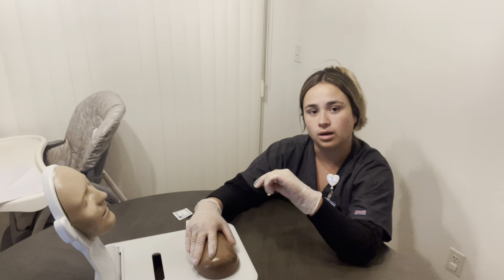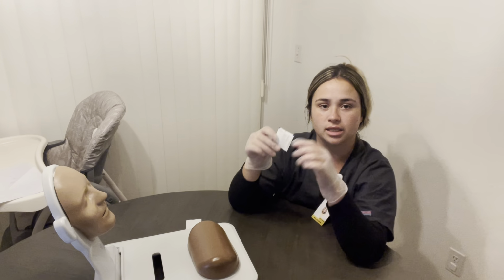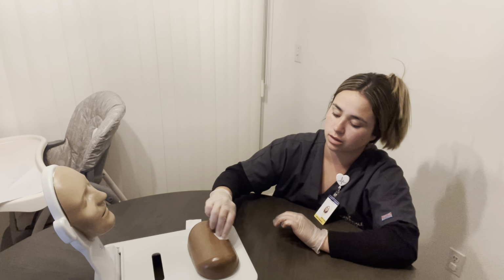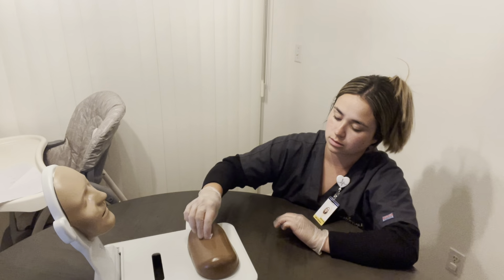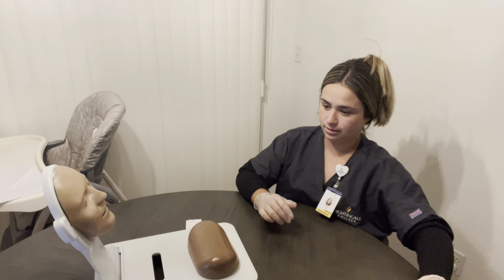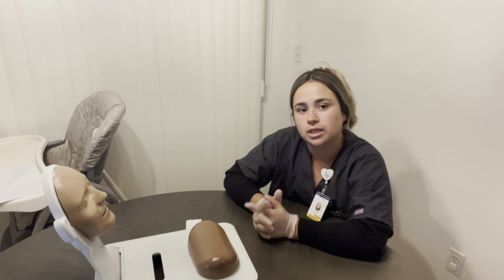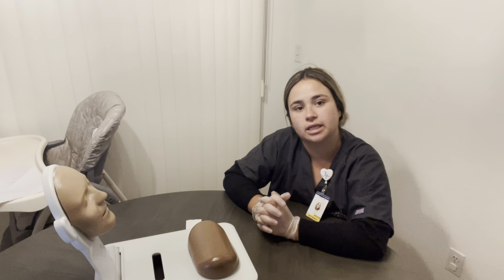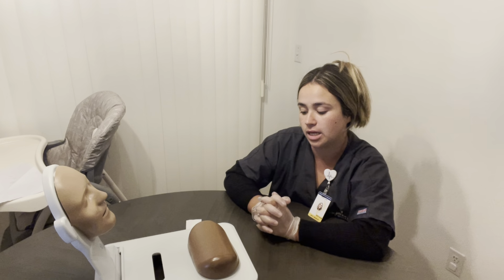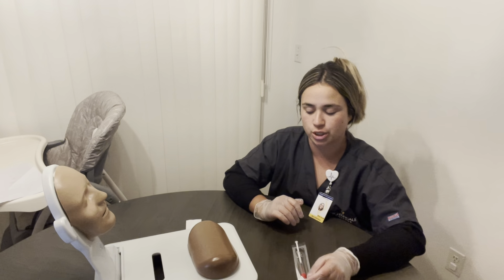So now that I've located the site, I can remove my hand and I will now clean the site, moving inner to outer. Dispose of that. Okay, and we don't want to blow on this or wave our hands to try and get it to dry. What we want to do is just let it air dry. Once it's ready, then we can go ahead and prepare to inject the medication.